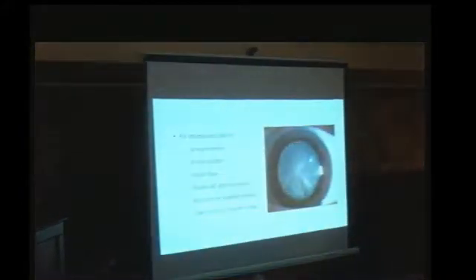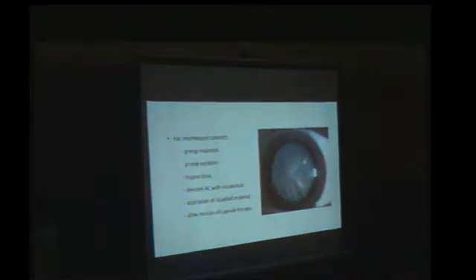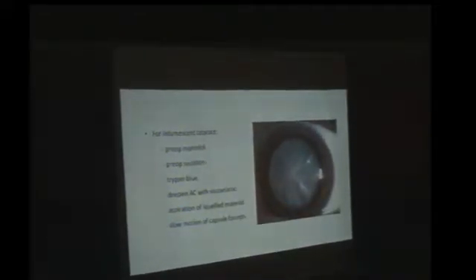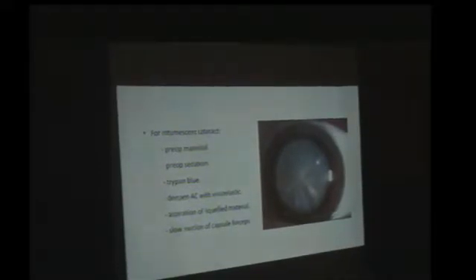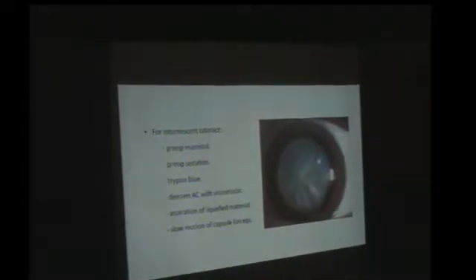العيان ده محتاج تحضير كويس، تديله الاوبراتيف سيديشن، تديله مانيتول، لازم تستخدم كبسول ستون، لازم تجيب الانتيريور تشامبر بفيسكولاستيك. لما تفتح الكبسول هتلاقي فيه فلويد طالع، الفلويد ده اعمل له اسبيريشن قبل ما تكمل الريكسس عشان ده بيقلل الانترا بريشر، فيقلل التنز على الريكسس انه يجري لبره.